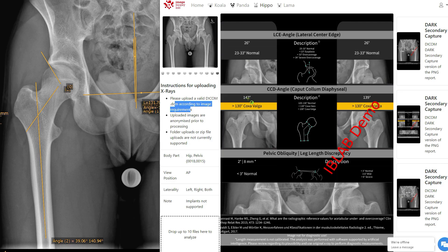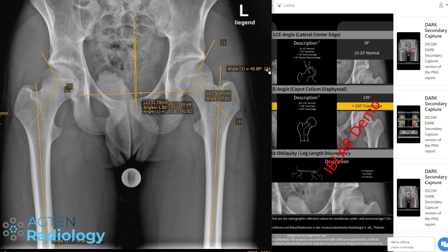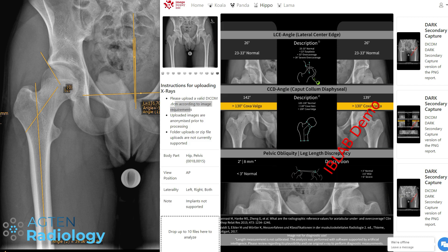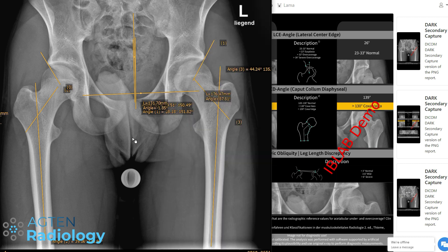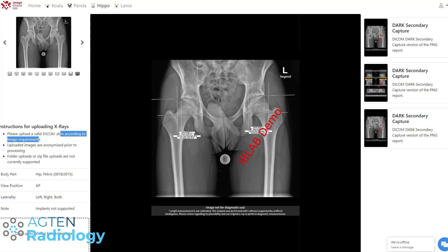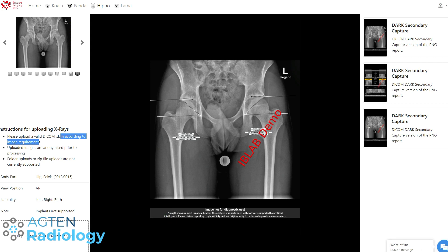Okay, you can now compare: I have 141 compared to 142 on the right hand side; 134 compared to 139; and 28 versus 29 or 30 — so we're about two to three degrees off. I think this is within normal limits, especially doing it that quickly. I managed to measure a few angles, but in the meantime the software was able to do way more measurements. You'd think that if you upload the same case twice it would come up with the same result — why don't we just try that?